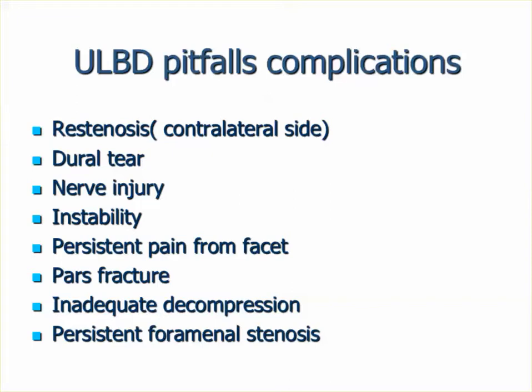the pitfalls are, if you do it from a unilateral side, there's always a chance that the opposite side can get stenotic. You can get a dural tear because the technique is more difficult. You can get a nerve injury.